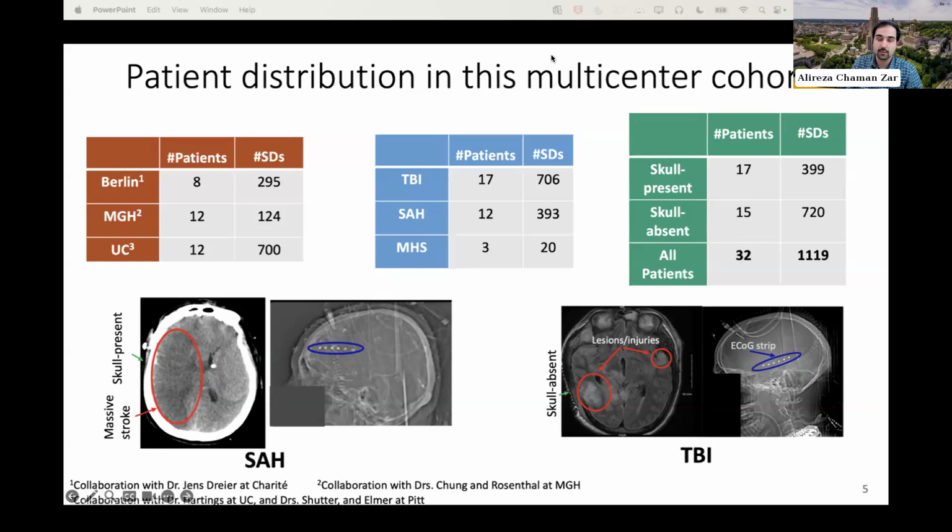And then also we had this parallel effort started with migraine with and without aura patients. So I would say the eventual goal is to help patients who will not go through invasive surgeries to have access to an automated way of monitoring worsening brain damage, which is mild TBI or concussion and migraine, where we don't have access to invasive monitoring. Especially if you're not able to get them into hospital. Yep, that's right.